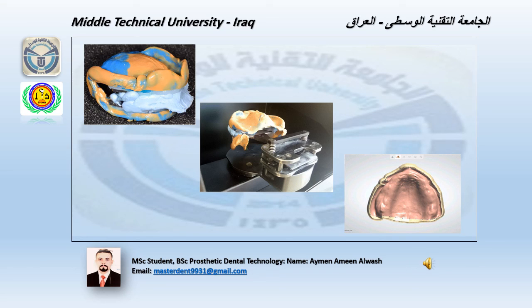Inject impression material between the upper and lower tray to save the relationship between the upper and lower tray without any changes. After that, the dentist will send the relationship to the dental lab. In the dental lab, they will scan the relationship and the upper and lower impression tray. This data will transfer to the specialized software and be recorded on the monitor. Now we are ready for complete denture fabrication.